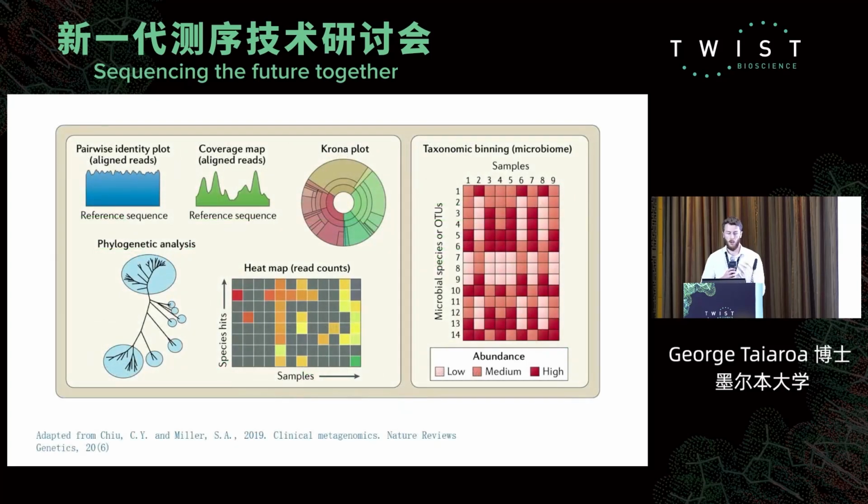And so this gives you a lot of information. This is just a quick overview slide, but it can tell you a number of bits of information that are clinically actionable or actionable on a public health level. So how related samples might be, if there are things like outbreaks, if an individual might have co-infections, which are quite often hard to identify using routine diagnostics, and other bits of information about the genotype of that pathogen to do with antiviral resistance or antibiotic resistance, things that can really guide therapy.